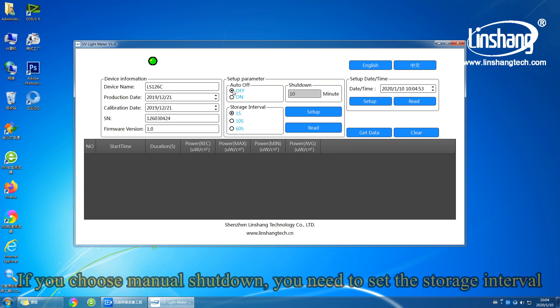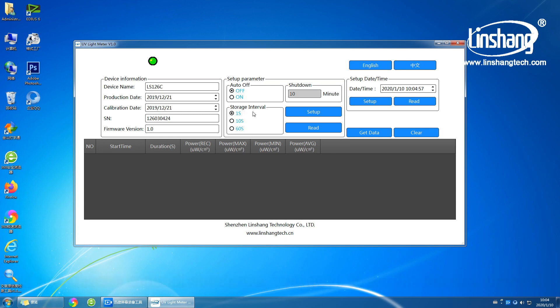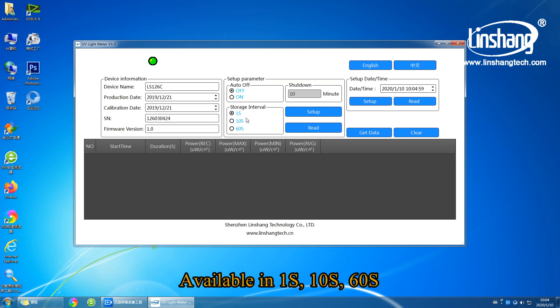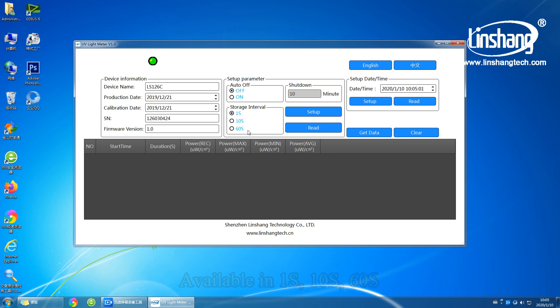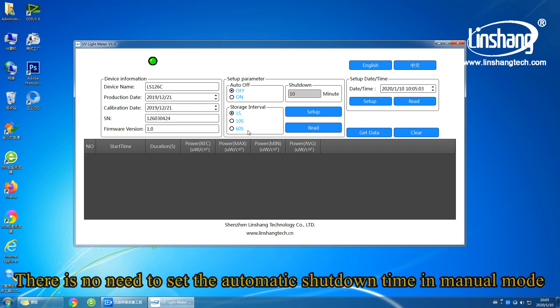If you choose manual shutdown, you need to set the storage interval. Available options are 1 second, 10 second, or 60 second. There is no need to set automatic shutdown time in manual mode.